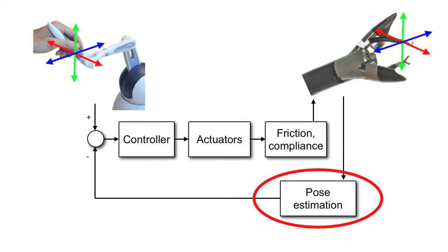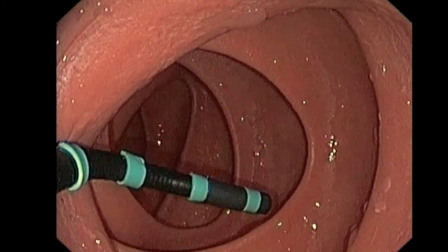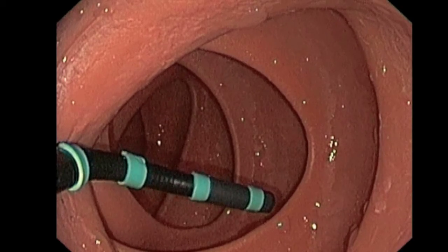We have developed a pose estimation algorithm that enables reconstruction of the instrument pose based solely on the endoscopic images, without adding sensors to the endoscope system. In this video, we will discuss this pose estimation algorithm. In order to enable accurate tracking of the instrument, we have placed 4 markers on it.